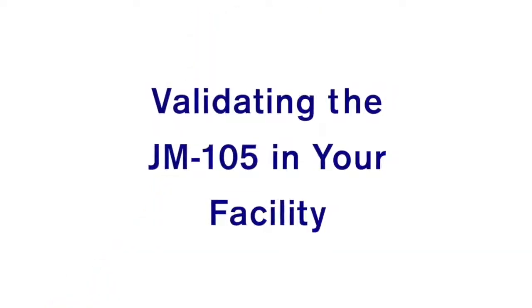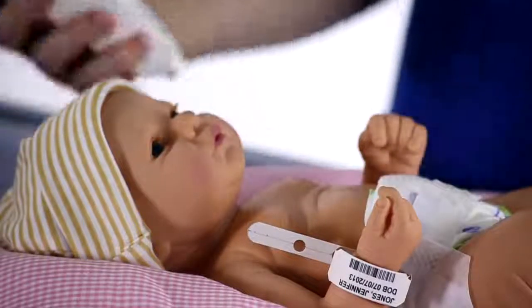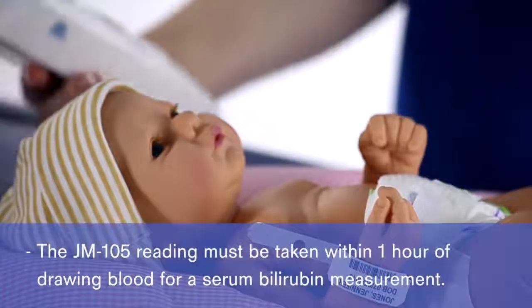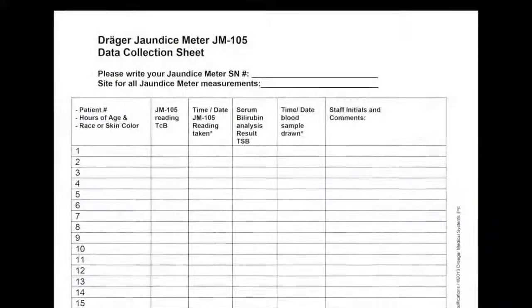Most users choose to validate the JM105 in their individual patient populations before putting it into clinical use. You can do this by taking jaundice readings with the JM105 on infants who are already scheduled to have blood drawn for serum bilirubin analysis in the lab. The JM105 reading must be taken within 1 hour of drawing blood for a serum bilirubin measurement. Record each JM105 reading and the corresponding serum bilirubin result from the lab on a datasheet like this one. When you have recorded enough simultaneous jaundice meter readings and serum bilirubin values, you can use this information to develop a protocol for use of the JM105 in your clinic or hospital.